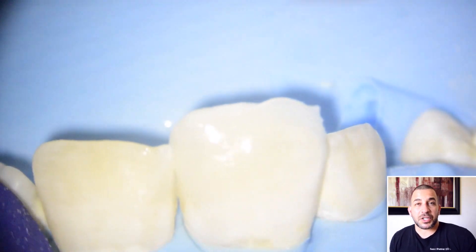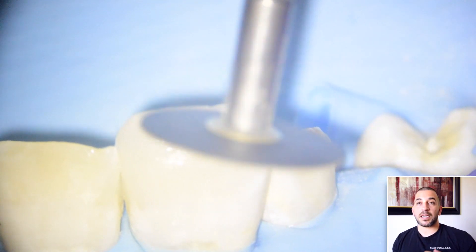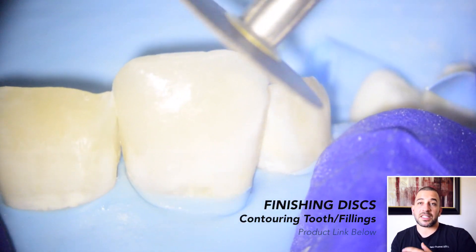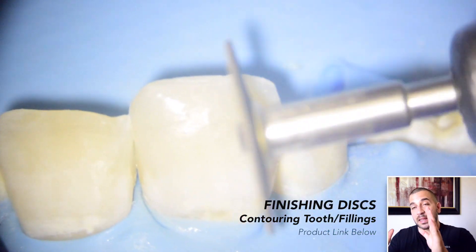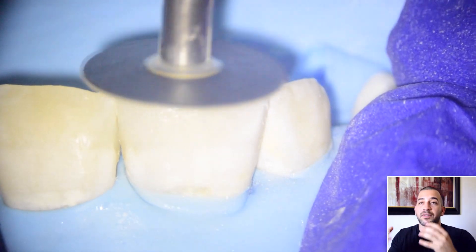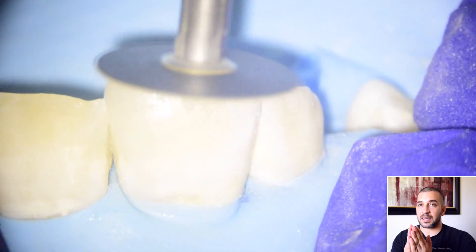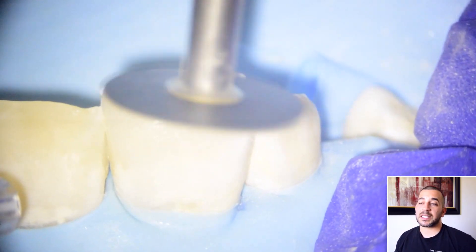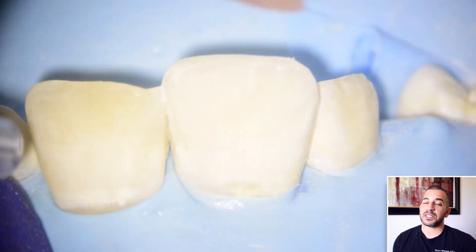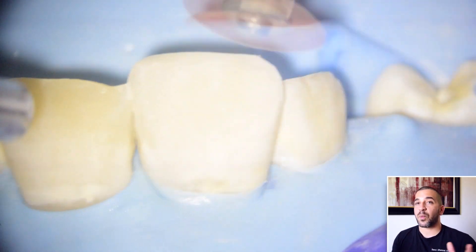The two main instruments I like to use when shaping teeth are the flame-shaped diamond burr as well as the discs. We can go from ultra coarse all the way to ultra fine disc, but when I'm shaping I stick to the coarse discs because it allows me to refine line angles how I want to, as well as shape the incisal edge — make it flat or give it whatever shape I want. In this particular case my cousin has very broad teeth with line angles that are extended a little bit more mesial-distally, and I wanted to give them more rounded corners and a more natural shape. As you can see here, when I'm using my discs I'm recontouring the line angles in a way that looks a bit more natural.